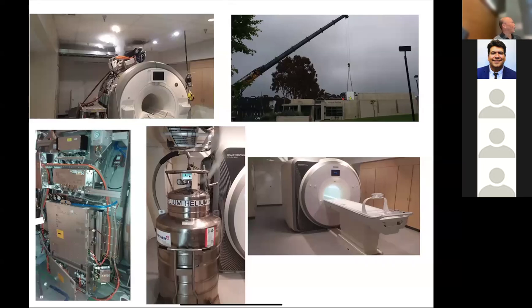Okay. And then the other time is sometimes magnets just quench for some unknown reason, like maybe some ice builds up or there's some problem in it, and it just spontaneously quenches. And that's also bad because if a magnet quenches in an uncontrolled fashion, it may not be possible to bring it back up to field. Okay. And unfortunately, we had a magnet where it quenched.